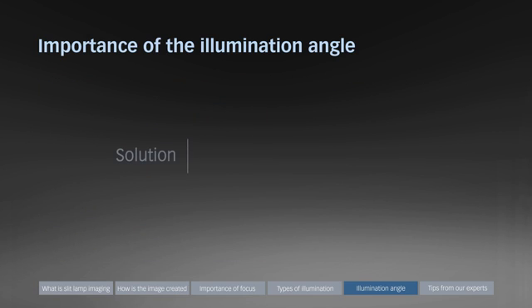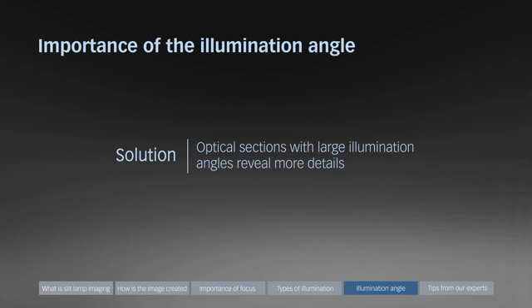The use of a large illumination angle is also beneficial in transparent media. Optical sections with large illumination angles reveal more details and can improve the depth of focus.